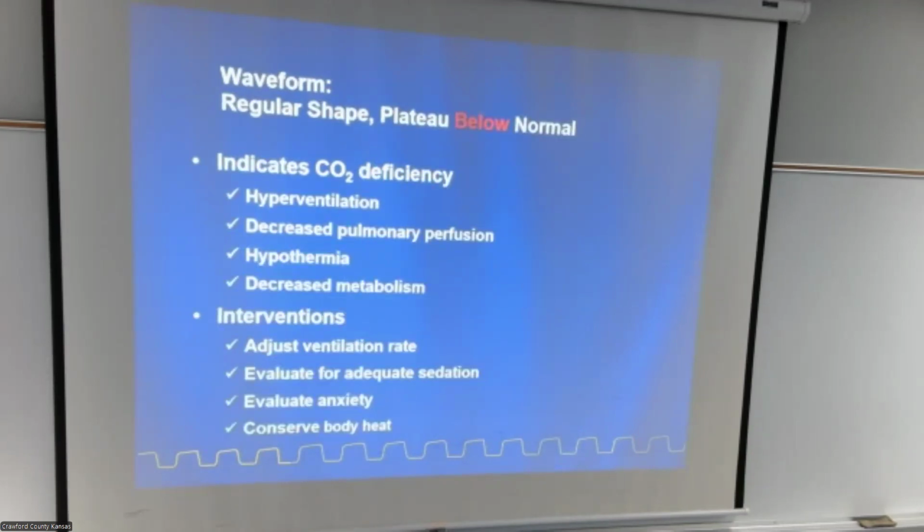So, causes: decreased CO2 production, hyperventilation, decreased pulmonary perfusion, hypothermia, and decreased metabolism. Interventions: adjust your vent rate, evaluate for adequate sedation, evaluate anxiety, of course, and conserve your body heat.